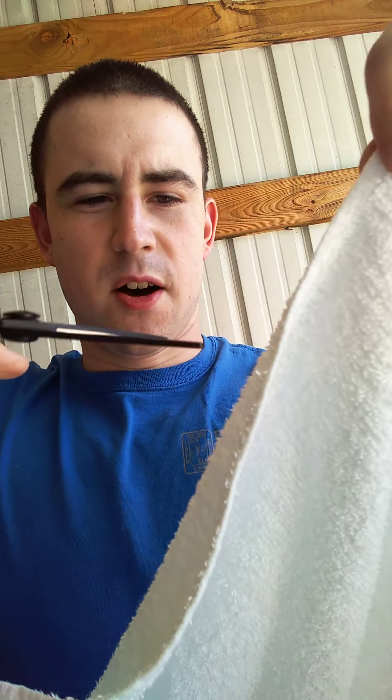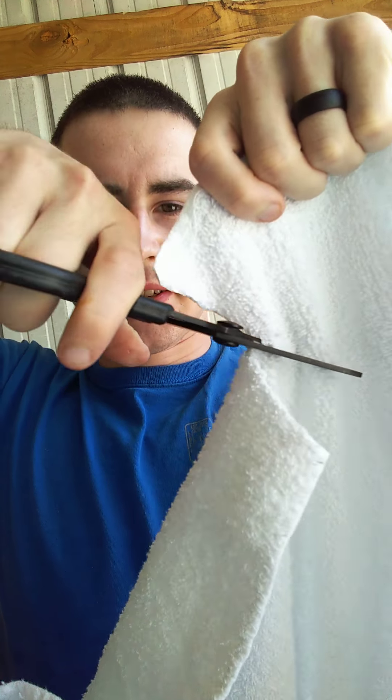I'll show you what I mean. So here I just have an old towel, and it cuts right through it — that's great. But most patients that you get out in the field, or even in the hospital setting, their clothing is going to be bunched up or it's going to be multiple layers.